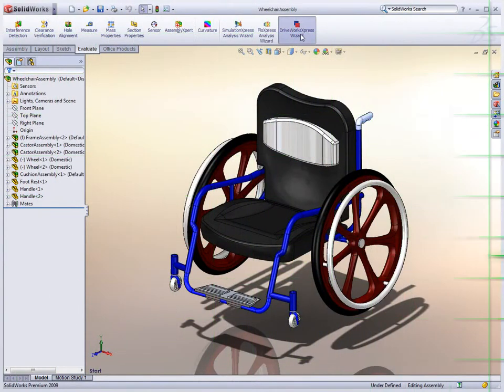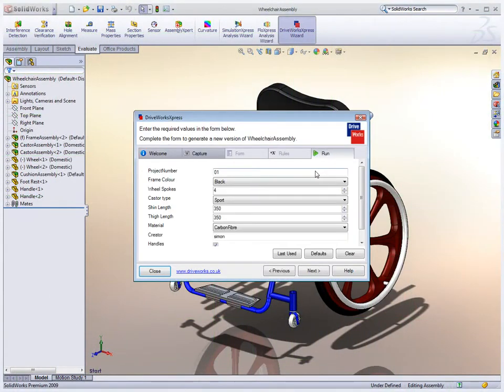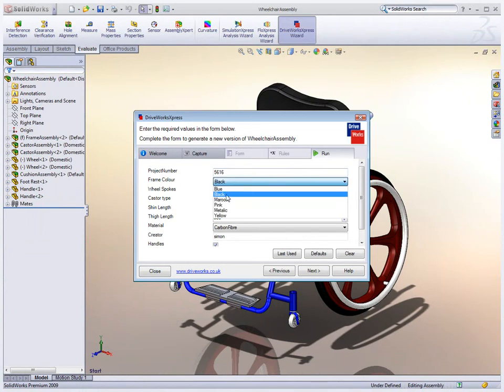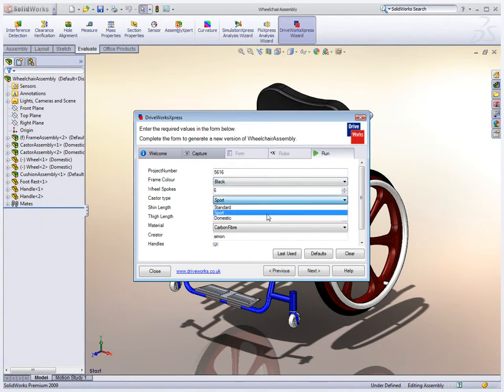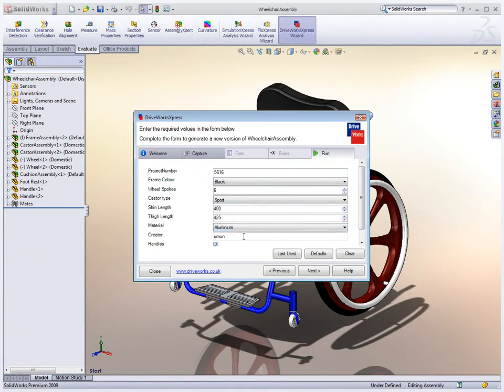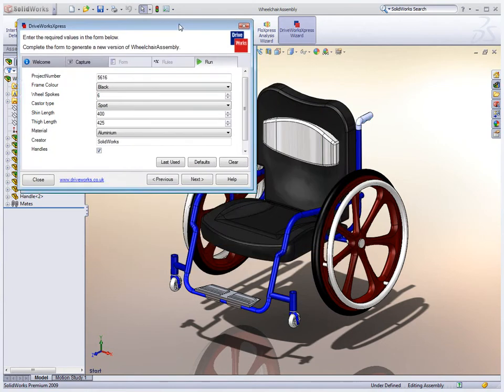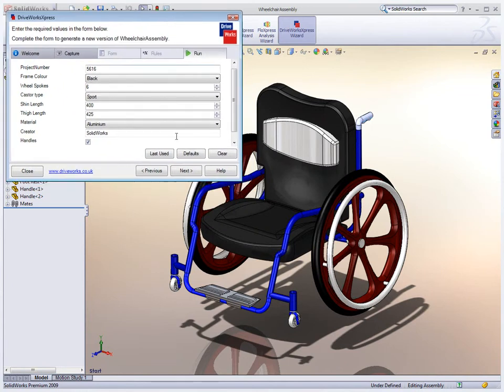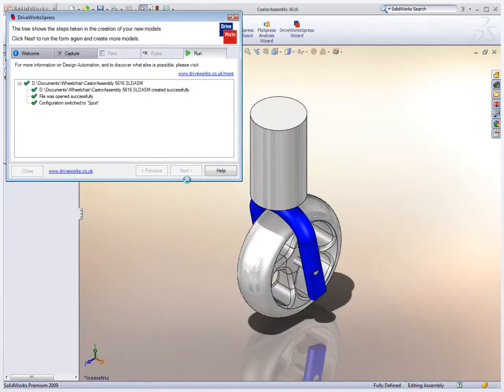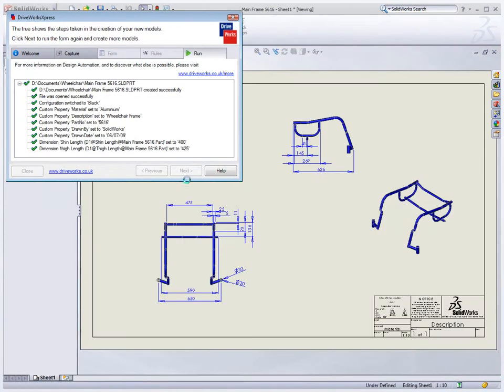If you have an ever-increasing list of product configurations, or every design is a custom design, DriveWorks Express in SOLIDWORKS can take care of this for you, building each design on demand. Products that range in size and shape to suit an individual's needs can be configured with ease. DriveWorks Express provides a simple way to create new designs by specifying characteristics which are unique to each variant.